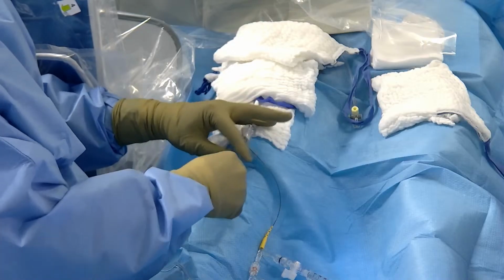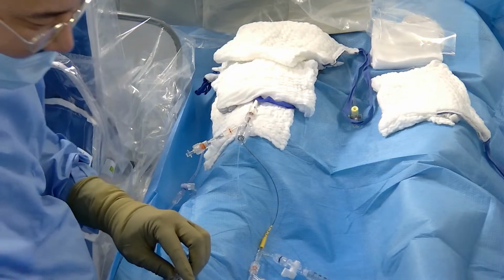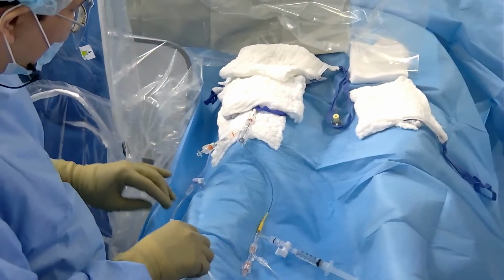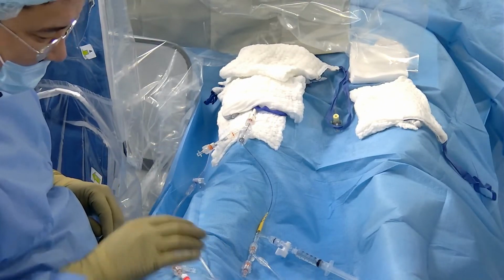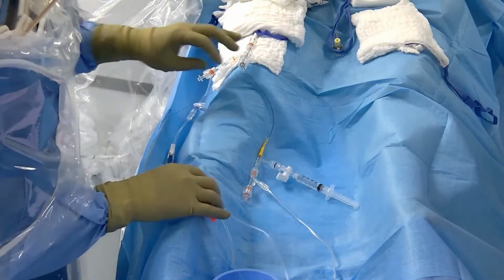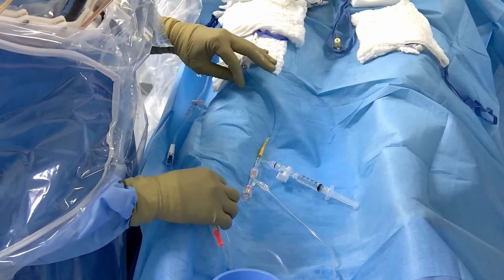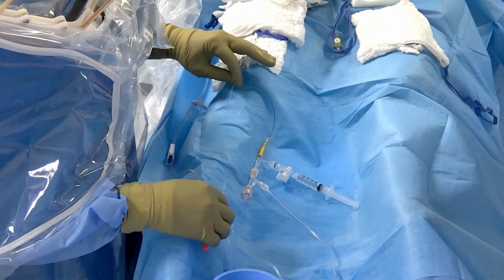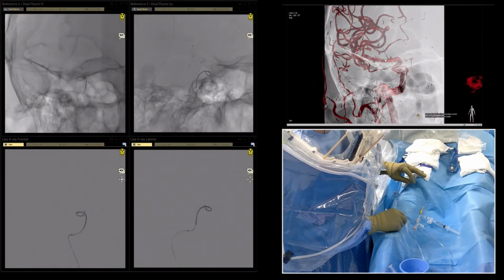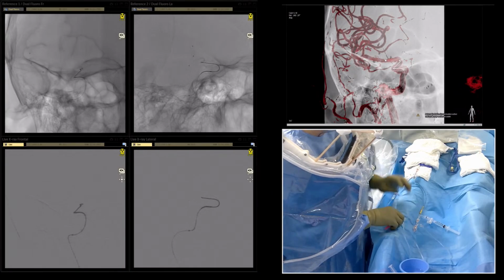There are also Gamma D. I think the difference between Gamma D and Gamma DS is just the softness of the distal part, and we order DS, which is, I think, softer. Yes, my assistant Rawan Aitili and the anesthesiology team, operating nurse is Zoya today. Okay, we'll have 3D roadmap for the navigation.